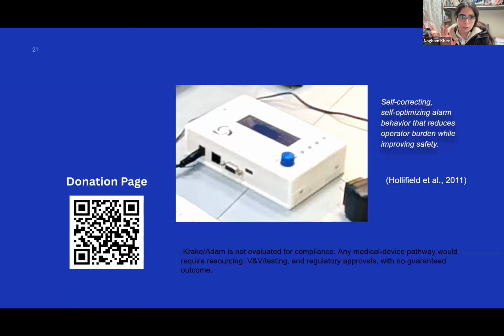The alarm that occurred more than 50%, like 50% of the total alarms, you need to look at that. It narrows it down for you to look at one alarm, and then maybe there's a set point that needs to be changed.